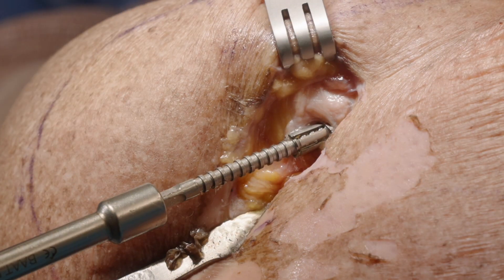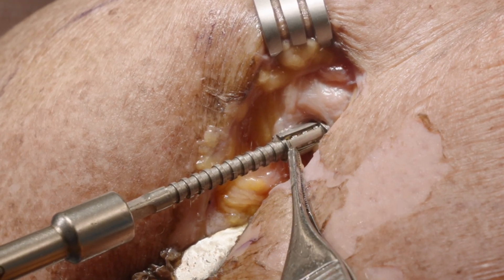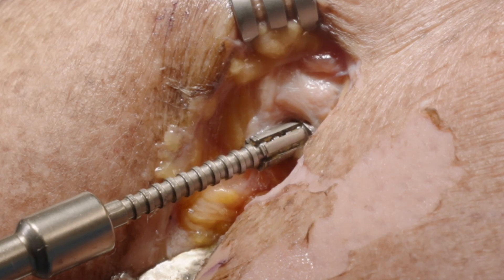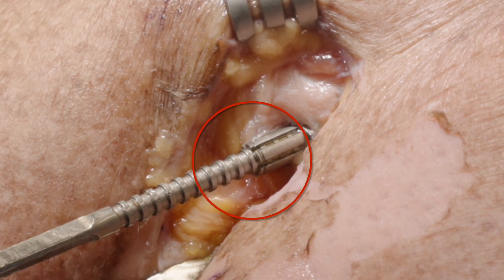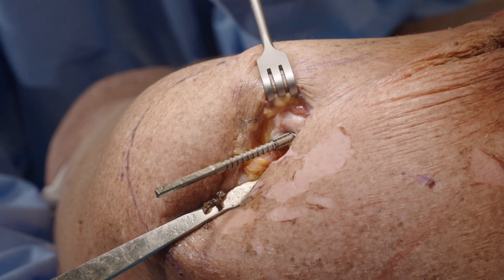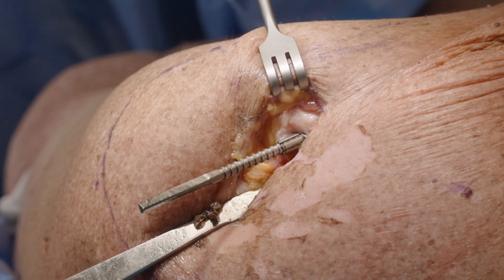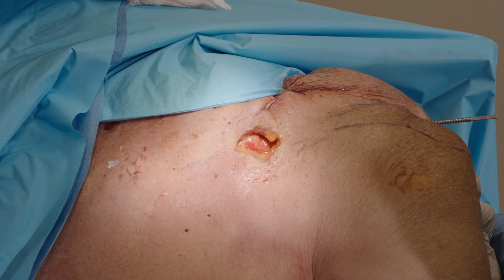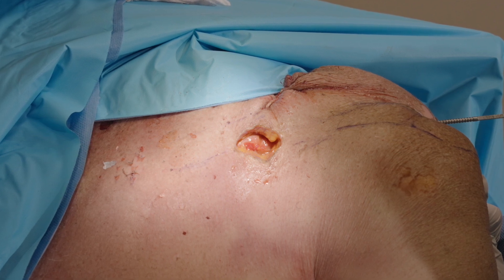Clear the implant from debris and adjust the Anser clavicle pin or Anser lateral fixation device to position the Anser lateral fixation device correctly. The marking on the resilient legs should line up with the indentation. Use the manual pin driver to adjust the position of the Anser clavicle pin in relation to the Anser lateral fixation device until proper positioning has been obtained. In case of incorrect positioning, it is not possible to place the Anser end cap. Do not push with force as this can damage the legs on the Anser lateral fixation device. Before securing the construct with the Anser end cap, check the reduction of the fracture elements. If needed, the length can still be adjusted.